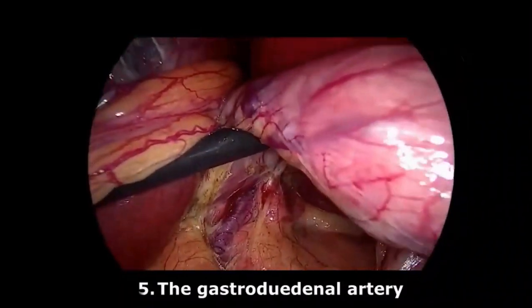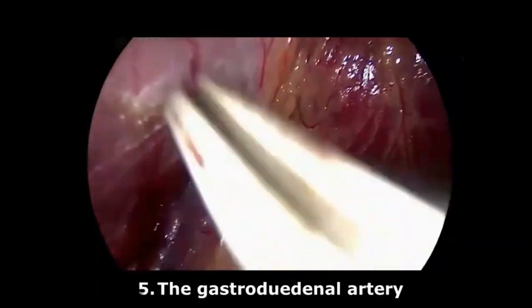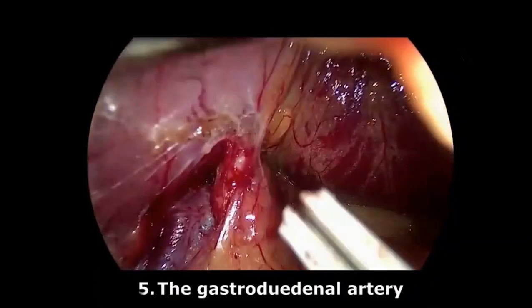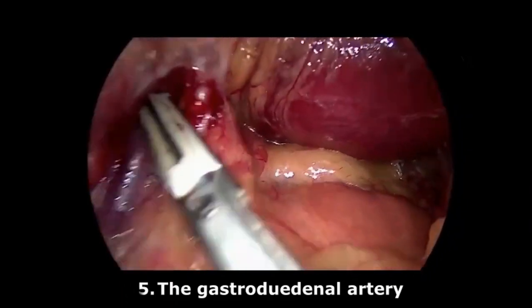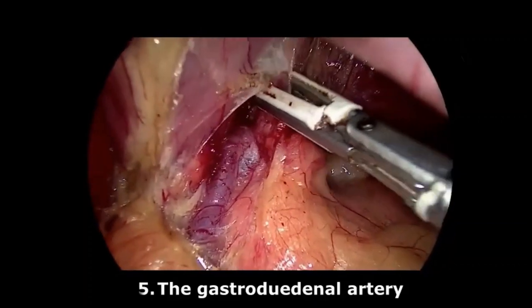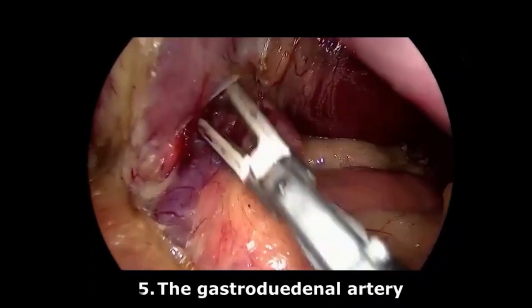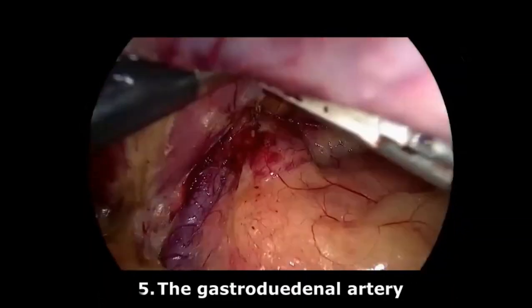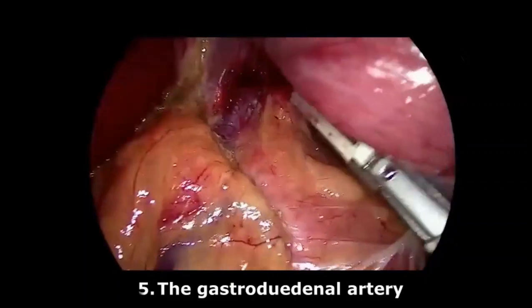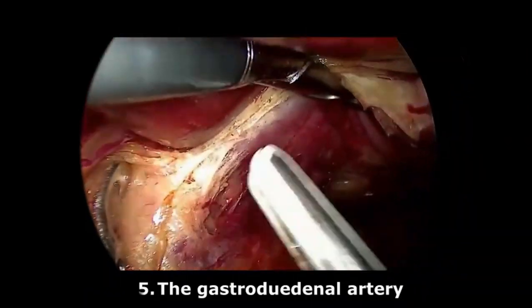Now I go parallel to the gastroduodenal artery. Going parallel to the gastroduodenal artery will always help me get a window. With this window I will encircle the first part of the duodenum with a tape and then pass a stapler to divide the duodenum. This is how I dissect for the window: some blunt dissection from below, then look from above, and some lateral dissection. These are my steps.